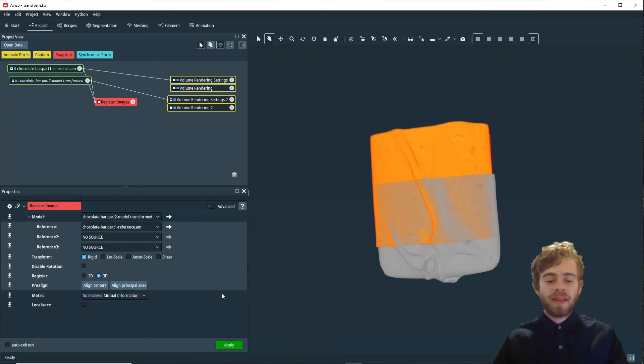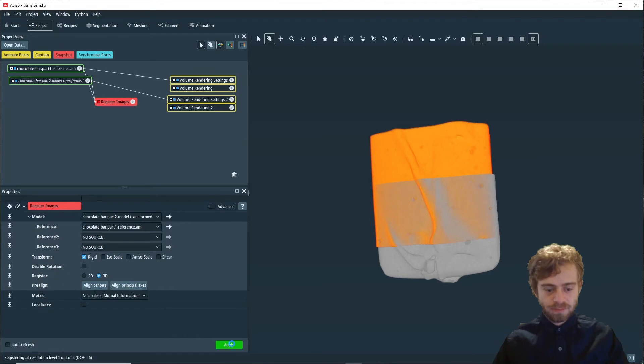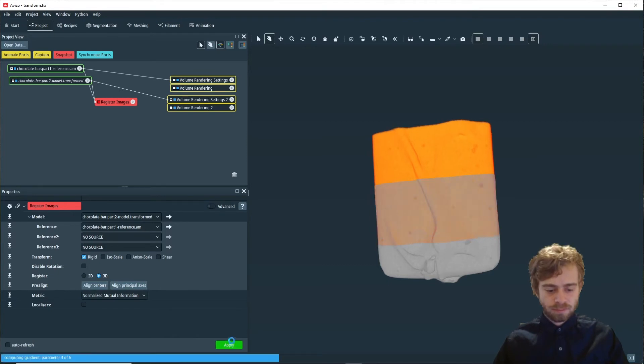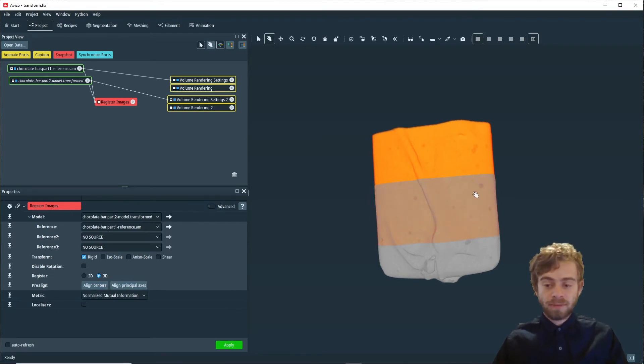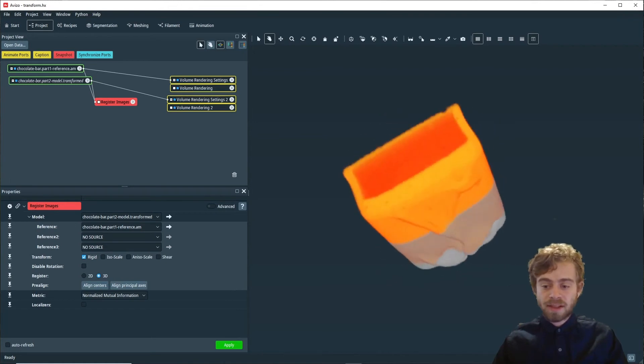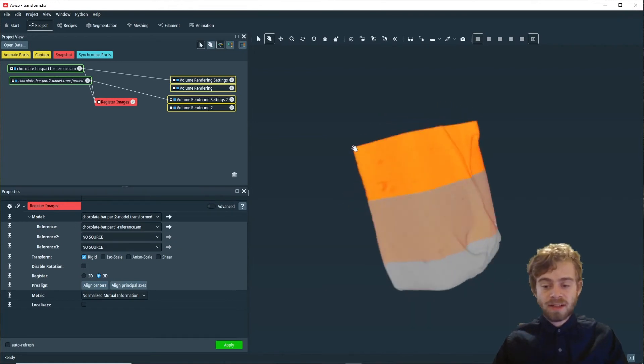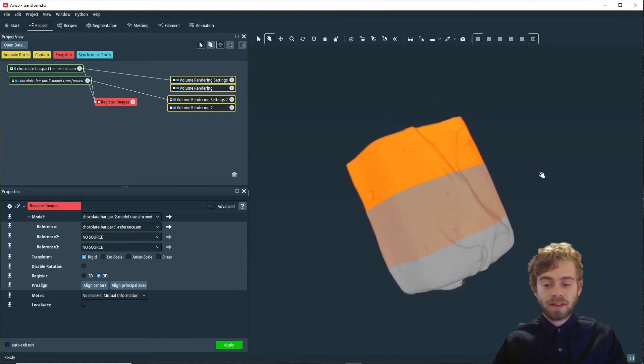With that, we're just going to click apply and see how it works. Awesome. It worked perfectly and we can see that the two datasets are now perfectly aligned.